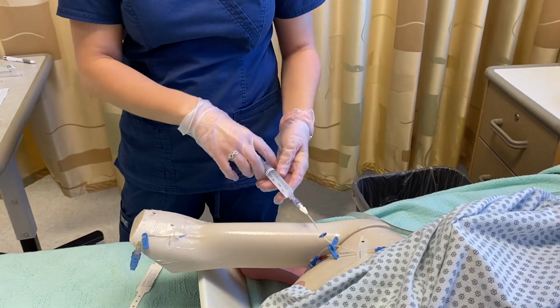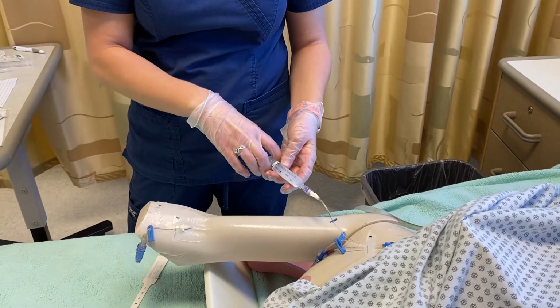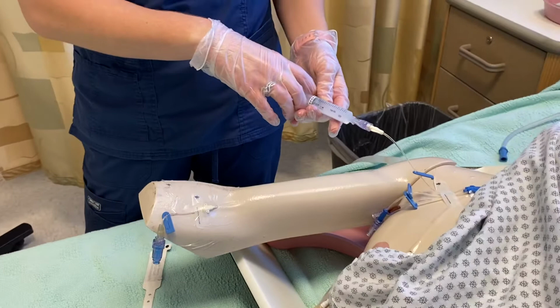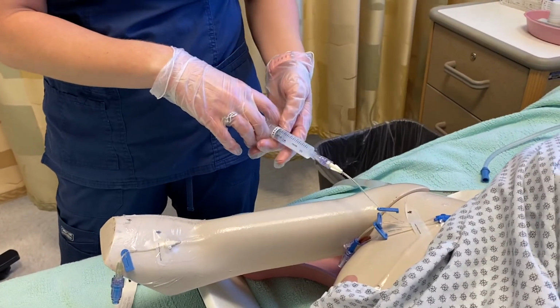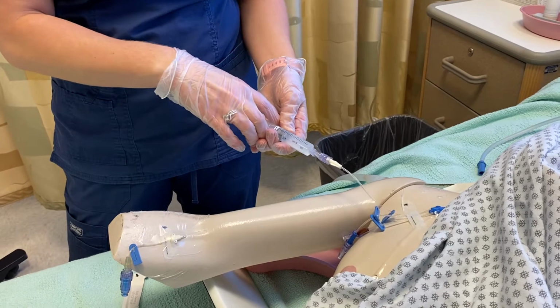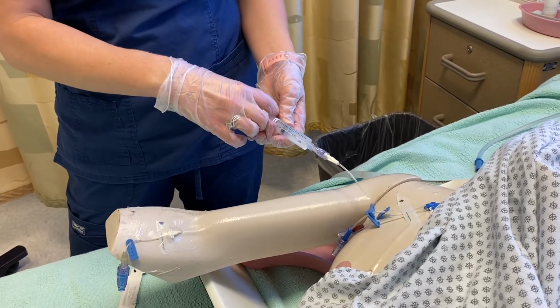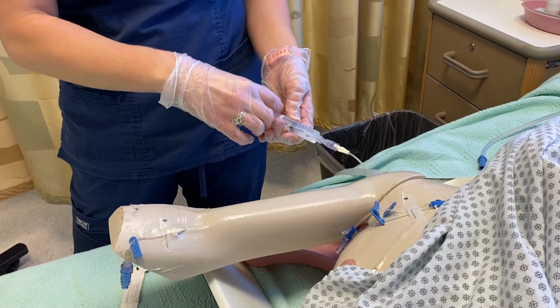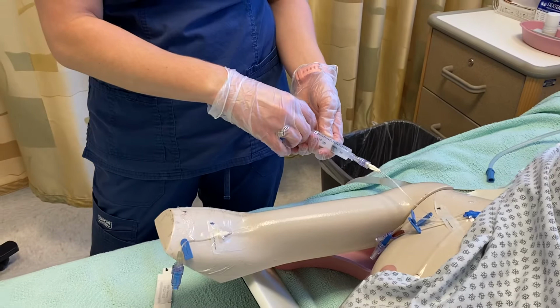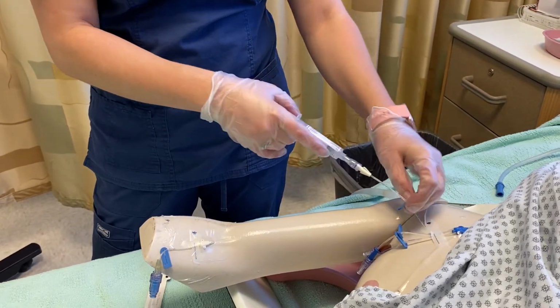And we're going to want to give this dose of saline at the same amount of time as the medication, because the lines are long, so there's still medication in the lines, and you don't want to give it too fast. Still watching for adverse reactions. Okay, we're going to say we're giving this at the right amount of time. We're going to clamp again.